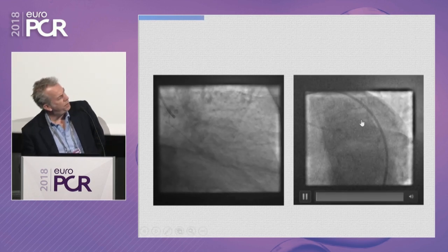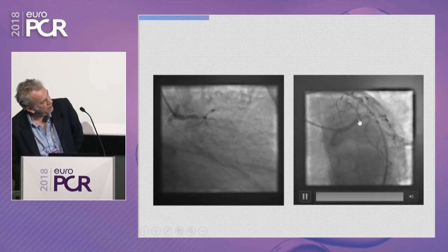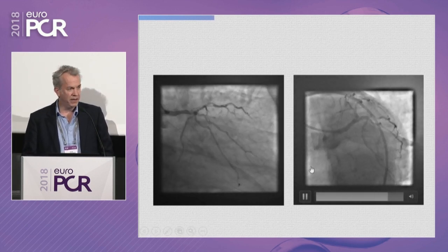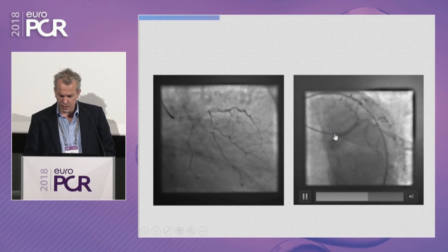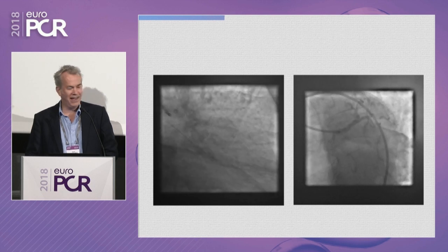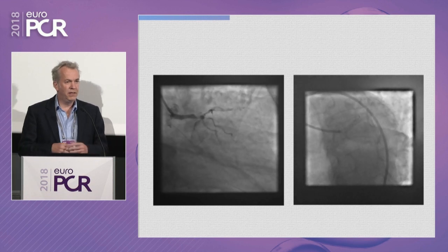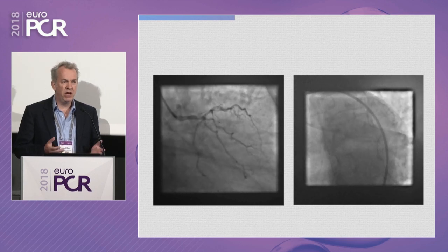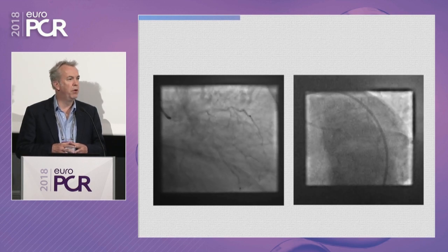I think here, I hope you can see it adequately. Just right here, right at the distal left main as it goes into the, yeah, where the little hand is. Oh, further down. Oh, it's terrible further down. Yes, yes. It's not quite, actually. I'm sorry. I don't know if you get to see it later, but I don't want to move the slide on. The mid to distal LAD is, I think, safe to say, diffusely diseased, quite poor quality. He's an elderly gentleman in whom we're not really considering a bypass operation. It doesn't seem an appropriate strategy for him.